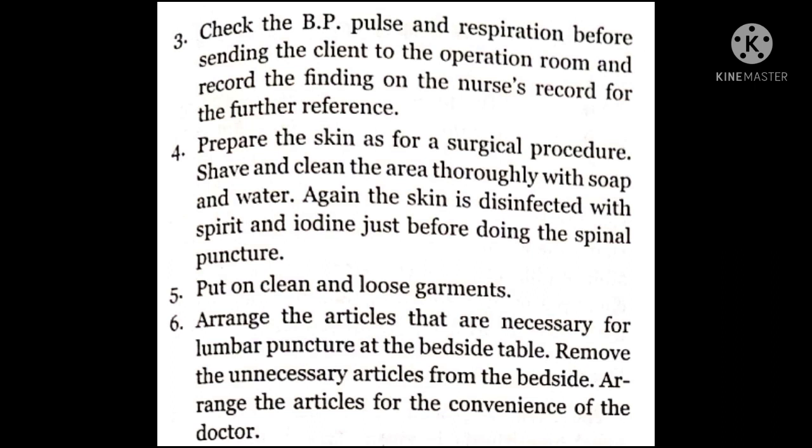5. Put on clean and loose garments. 6. Arrange the articles that are necessary for lumbar puncture at the bedside table. Remove the unnecessary articles from the bedside. Arrange the articles for the convenience of the doctor.